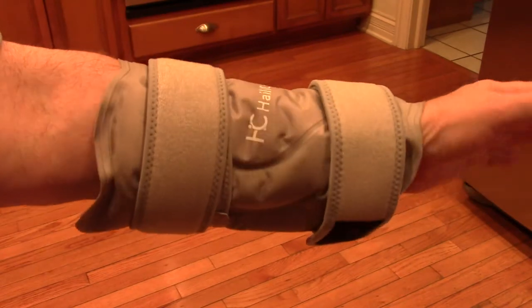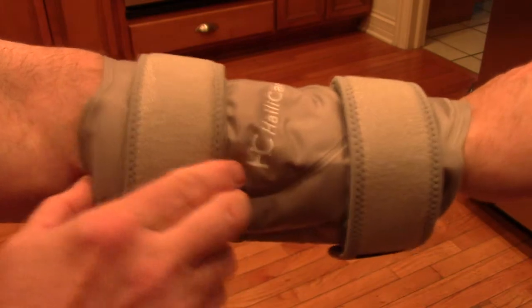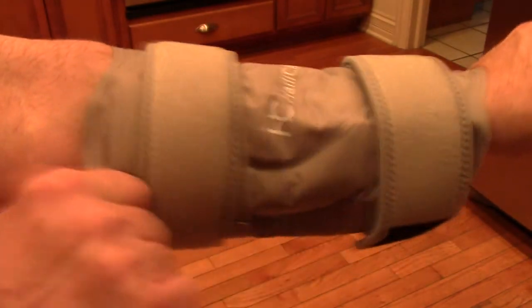Here I have it on my arm, and by adjusting the straps it works perfectly there also. It feels really good — you can see it's really secure on there.